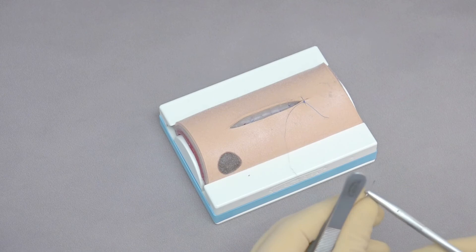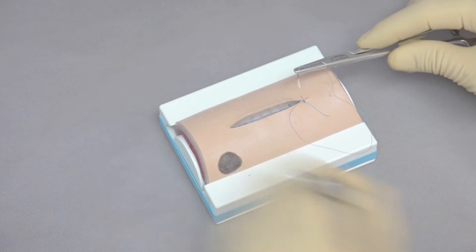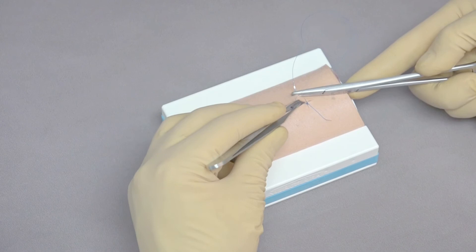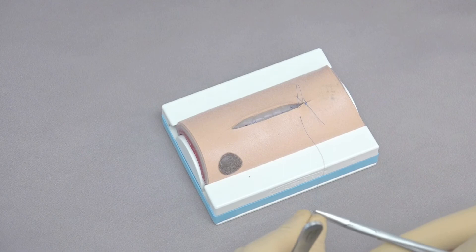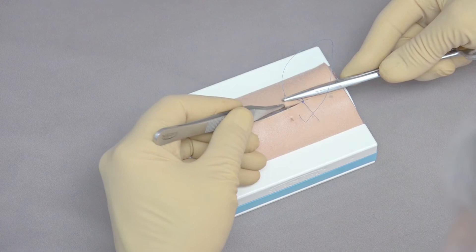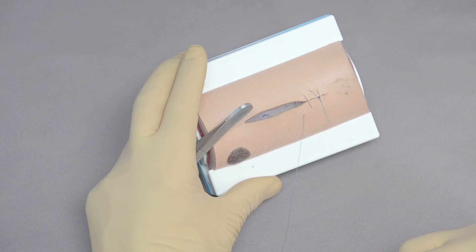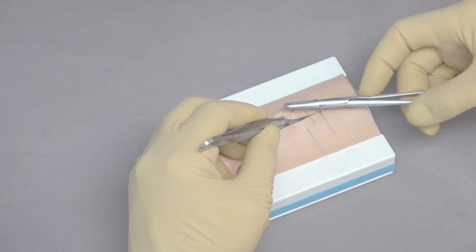Grab the needle, reposition, and because the skin is held nicely in the tensioning base, you don't actually need to hold it with thumb forceps — gripping with forceps causes trauma to tissue. Use the needle to come across, about four to five millimeters on either side. You can come through one side at a time, reposition the needle, or if the skin edges are close enough, come all the way across in one bite. The challenge with one bite is ensuring the distance on both sides of the incision is even, as that gives the most functional and cosmetic result. Going through one side at a time is generally better for consistency.